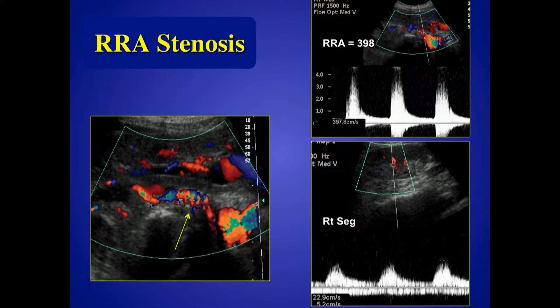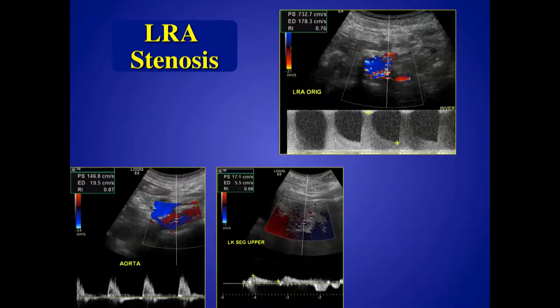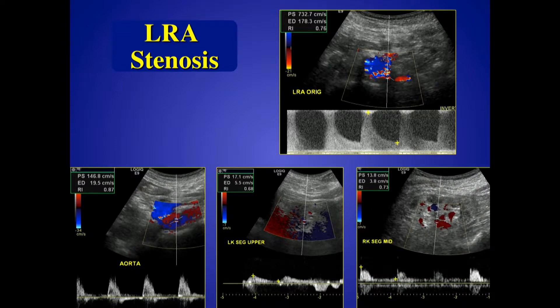Here's a stenosis in the proximal right renal artery — you can see the aliasing, the velocity is almost 400, and you can see tardus waveforms inside the kidney. Here's the left renal artery — turbulence and aliasing at the origin. The velocity is over 700 centimeters per second, more than three times the velocity in the aorta. Classic tardus-parvus in the left kidney. If you're not sure whether it's tardus-parvus, bring up the right side — the right side has a perfect upstroke with an early systolic compliance peak. Big difference between the waveforms when you're comparing.